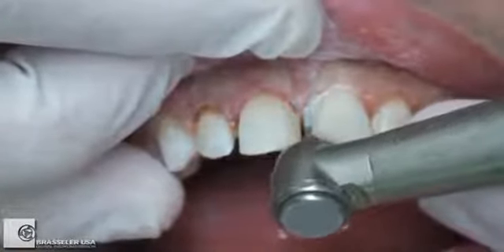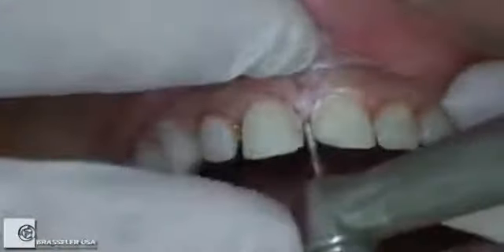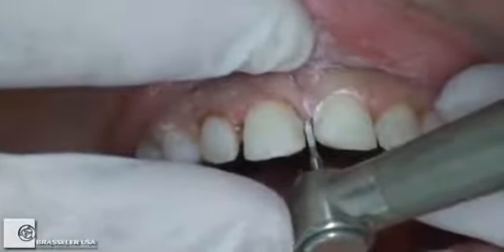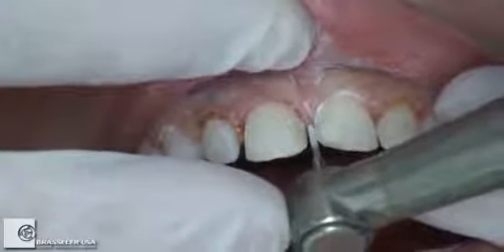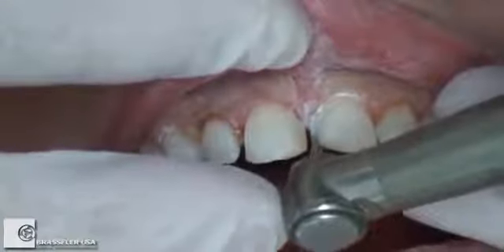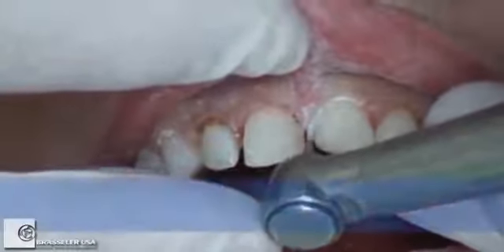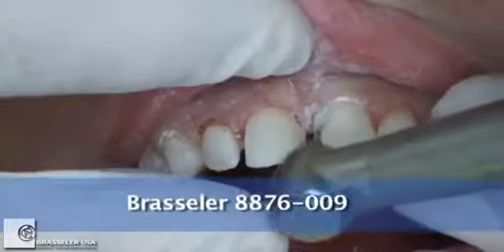Since I'm going to prepare teeth already, since we're in a preparation situation here, I like to have a finish line. If it was a no prep veneer, obviously we wouldn't put any finish line, and we need a very thin veneer, especially at the gingival area. There's not a major color shift at the gingival area. I like a fine diamond to put the little finish line on. I use an 8876 from Brasseler.